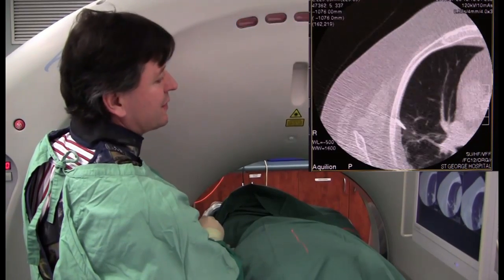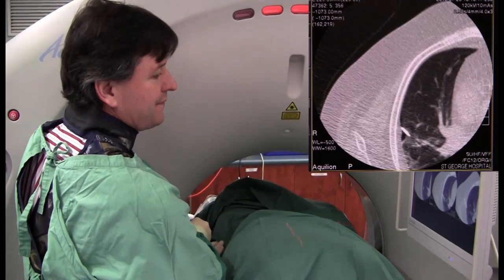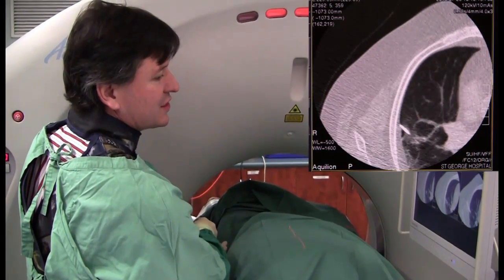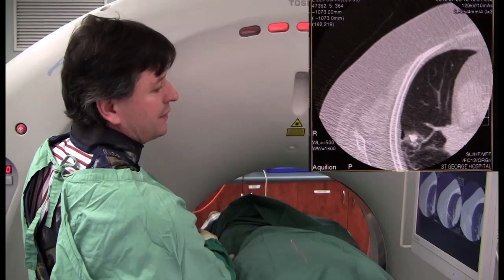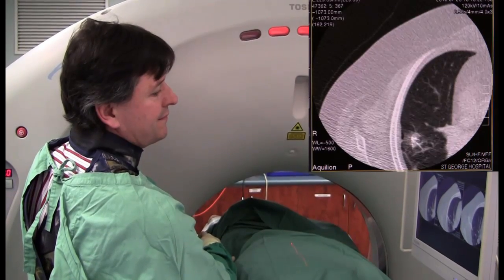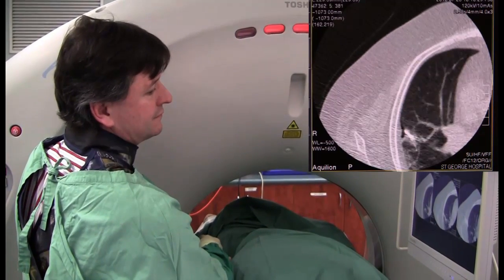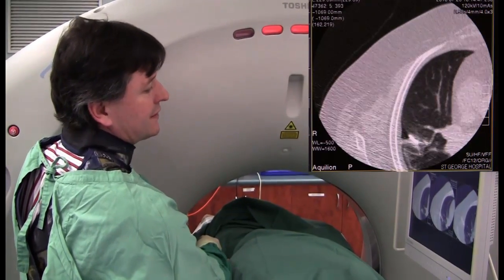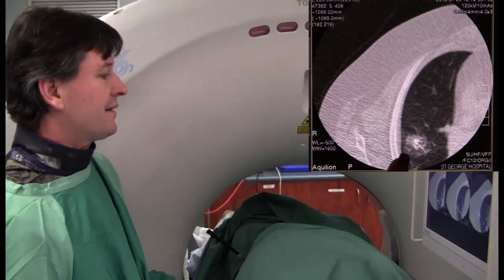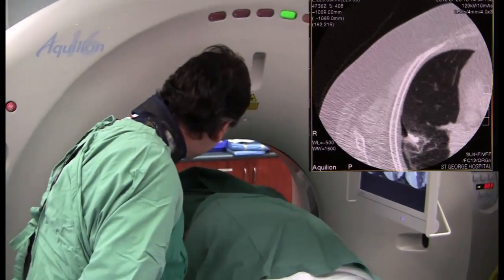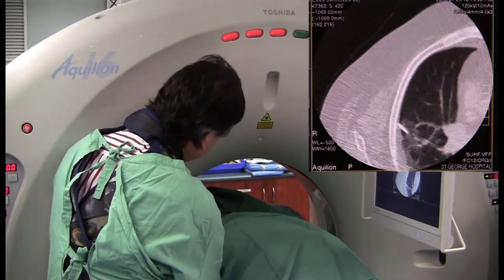The advantage of watching in real time is you can basically change things as you go along — for example, if you get a pneumothorax you can just change shape and adjust. Taking it out to two centimetres, deploying the tines. That's the picture we're looking to see — it puts the lesion in the middle of the deployed tines at two centimetres tine deployment.